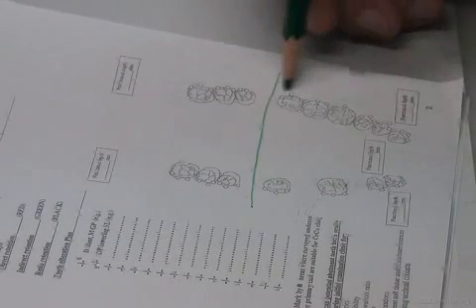I have the option of putting a rest on the 8 and doing the double rests here, or the rest on the mesial of the 7, double rest, mesial and distal of the 6 as well, and double rests. These are all options. Okay? The double rests provide me with two clasps, so I could eliminate the clasp here. So a design, first of all, to recapitulate: a design is looking for the support, providing the basic design for the support, then beginning modification. The modifications are either changing, adding, or removing components. Okay? Yeah, the next design.